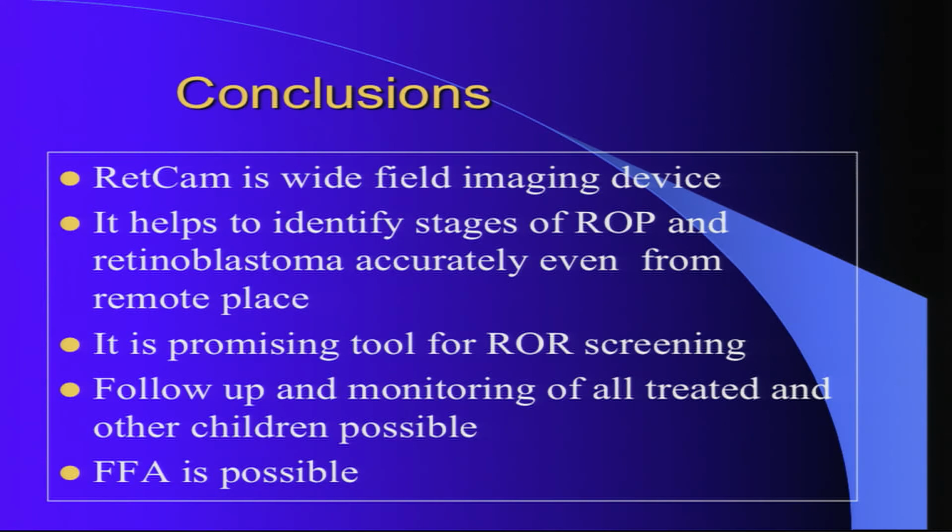Once they grow up, maybe you can use it sometimes under general anesthesia. It becomes very difficult and challenging because it's a contact device. It helps you to identify the stages of ROP and retinoblastoma accurately, even from a remote place. You can consult an expert anywhere. And it is a promising tool for ROP screening.